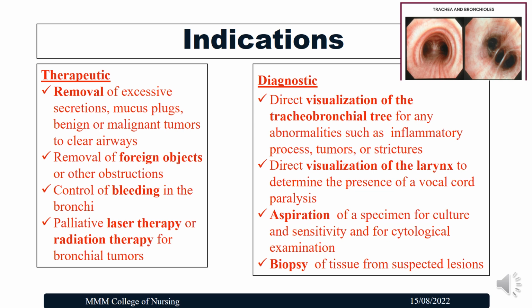Removal of any foreign objects or any other obstructions in the respiratory tract. Control of bleeding in the bronchi, or it can be used as palliative care, for laser therapy or radiation therapy for the bronchial tumors. So these are some of the therapeutic indications of bronchoscopy.